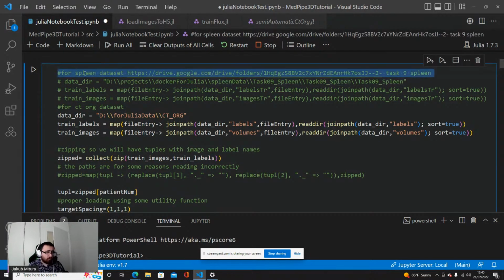There were some technical problems with the description of the YouTube video.